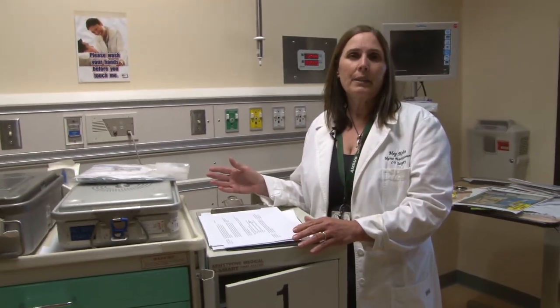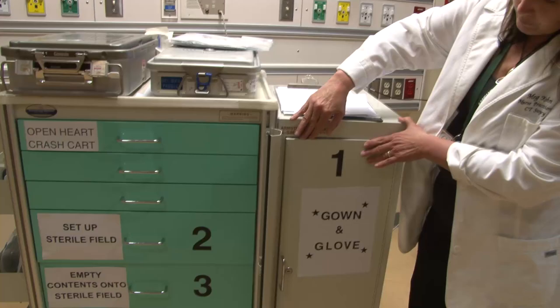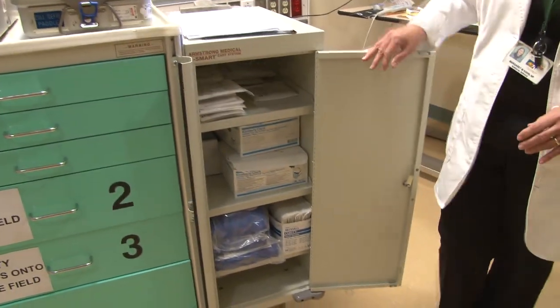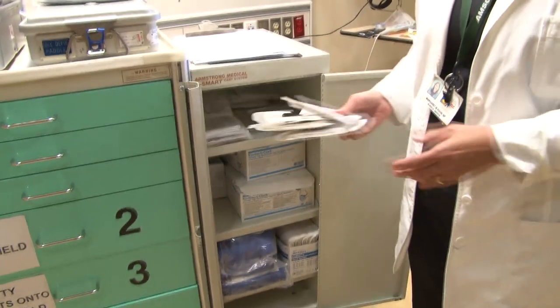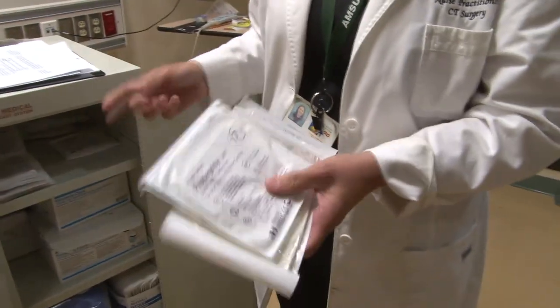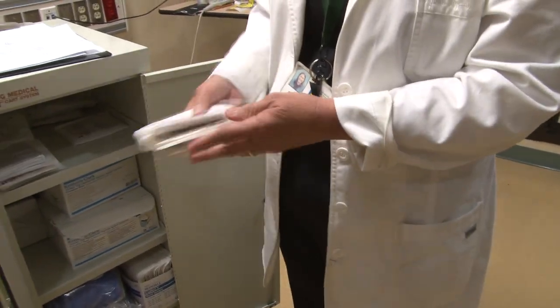In the next five minutes we're going to go through the sequence of events that it takes to open a chest at the bedside in a timely manner. You'll see that it's as easy as one, two, three. Even the most inexperienced resident, nurse, or any team member can help assist the surgeon in getting the chest open.